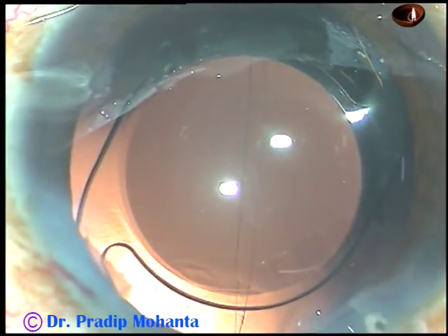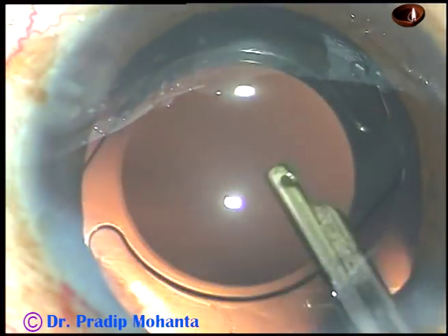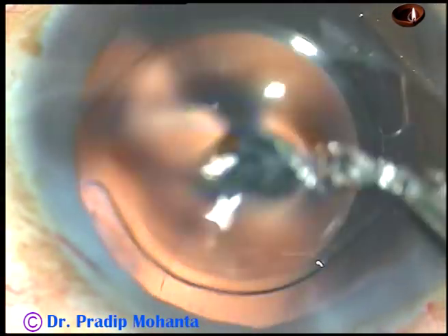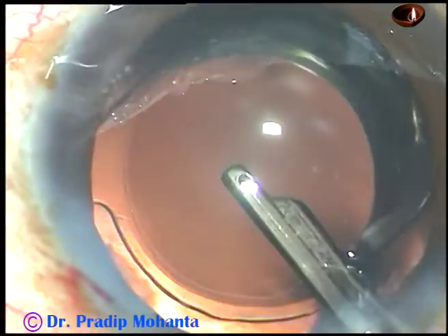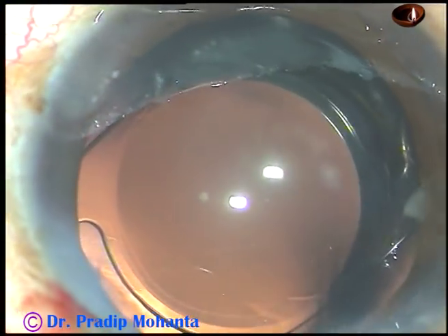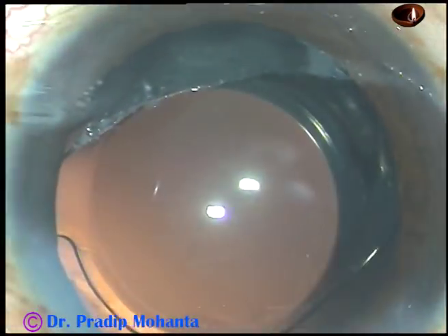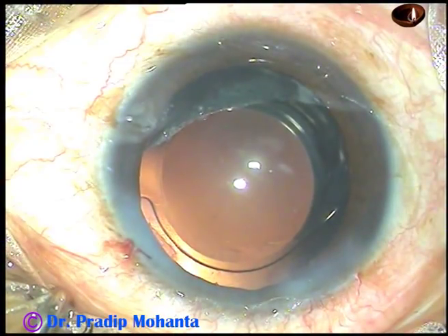This is how you form the anterior chamber. Here I am going behind the eye and doing this final lavage. Now I am happy that the anterior chamber is shining. And this is how I form the anterior chamber. Check the integrity of the wounds — the main incision doesn't require hydration. And then the case is concluded.